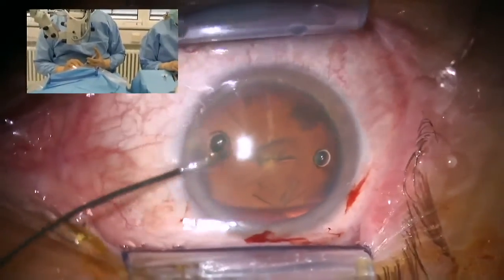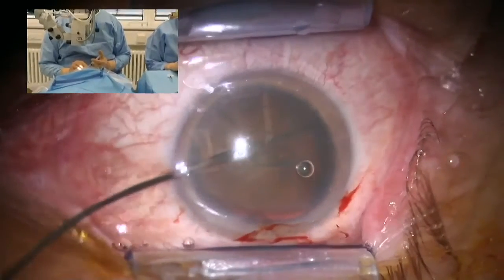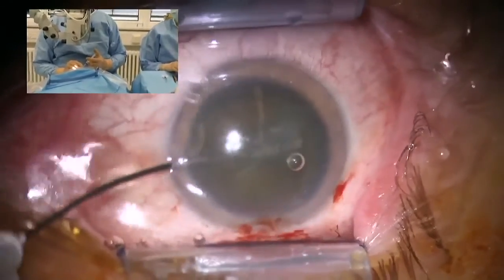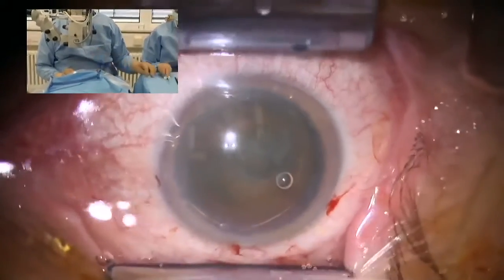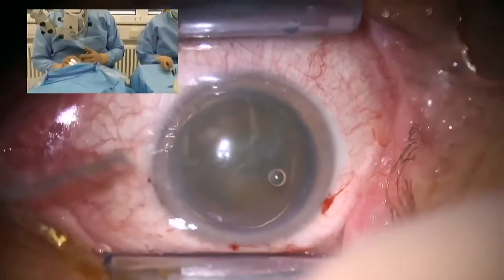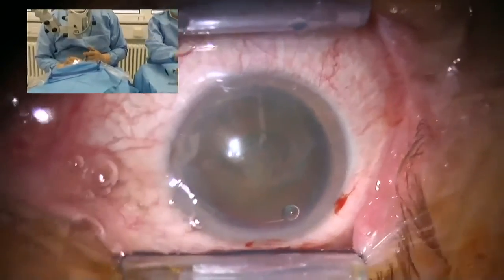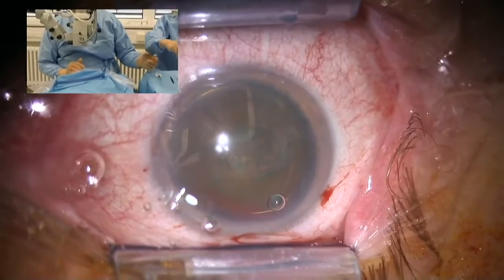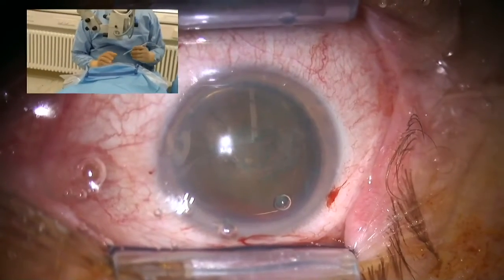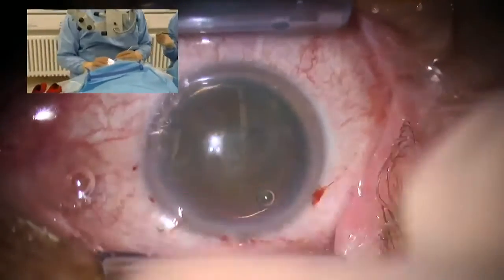So what you basically do is behave like you are doing a vitrectomy with your phaco machine. And those air pulses are transduced into electrical pulses inside the laser. If you have, let's say, 500 cuts per minute vitrectomy frequency, you will end up with a frequency of 8 hertz of the nanolaser.